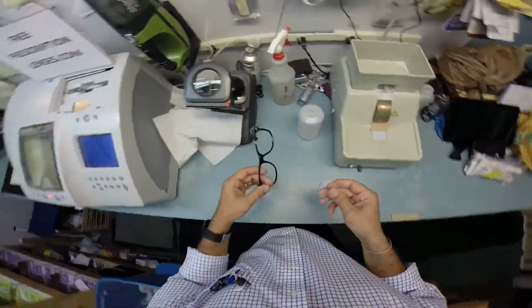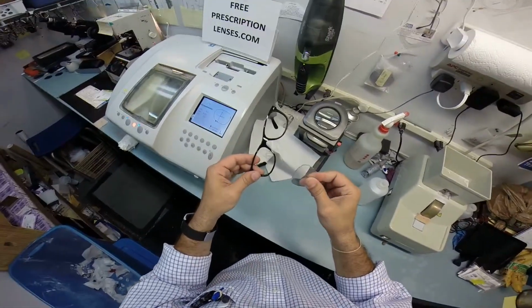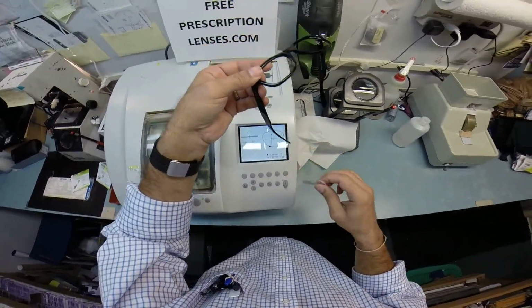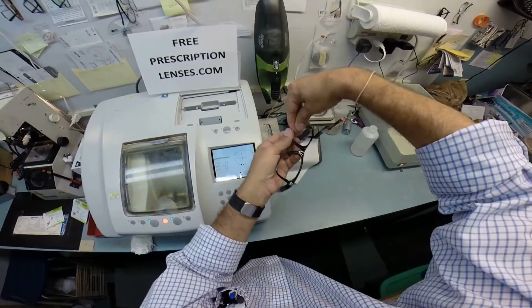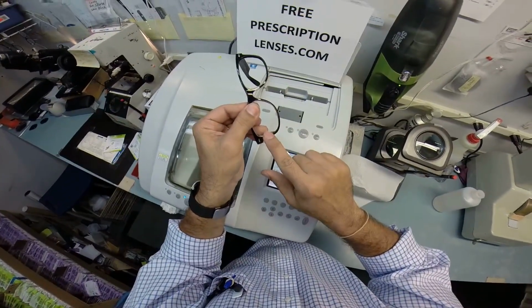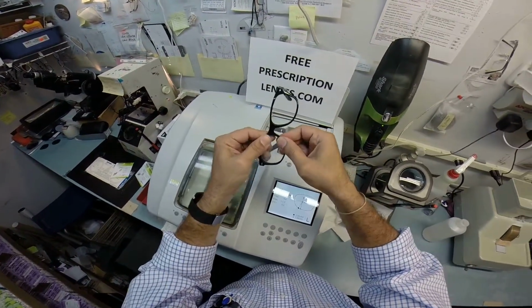Now, in order to change the lenses years from now, because I've been wearing my same frame for 4 years, but I've put 3 different prescriptions in there. Again, to put your lenses in, I have the frame with the lenses pointed upright, the temple tips pointed downward, and I have the side I'm working on closest to me. I'm not trying to reach across the frame to work on it. I turn it around this way, so again, I tuck it in at the outside corner, which is closest to you, closest to your chest. Using your thumbs, you push down at the nose.